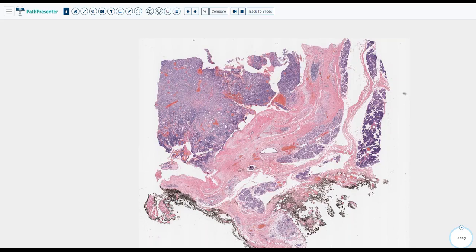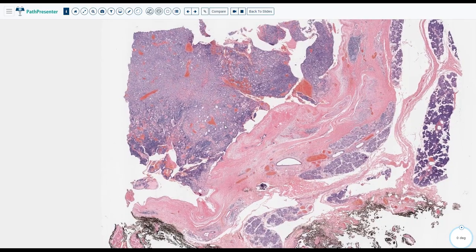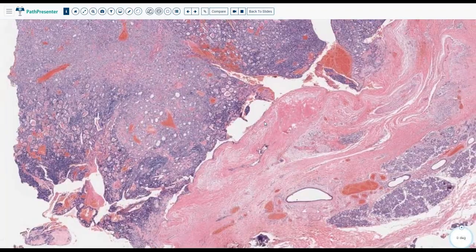All right, good job. Again, we are dealing with another salivary gland lesion. It can be seen with perineural invasion. It's not common. It's not something that you'll be surprised to see, but also I won't be that much surprised if I didn't see it. So I won't really kill myself over perineural invasion. Usually you don't see it much. Okay. Okie dokie. All right.